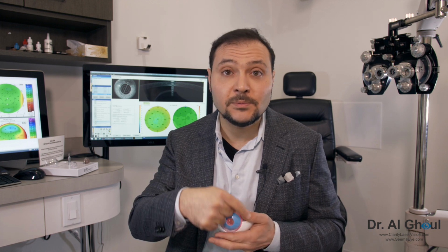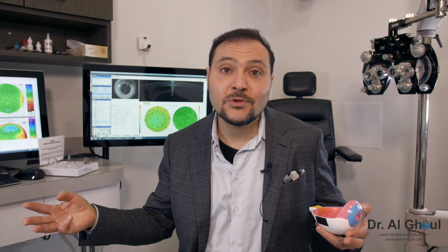And what's also really cool is now this lens corrects astigmatism. So now the opportunities to take a refractive error and correct it are much better than previously because number one, we're not having to make any manipulation to the eye. Number two, we're able to correct astigmatism. And number three, we have such a large range of correction. We can go up to -20 now. That gives us a lot of opportunities to help a lot of folks out there.